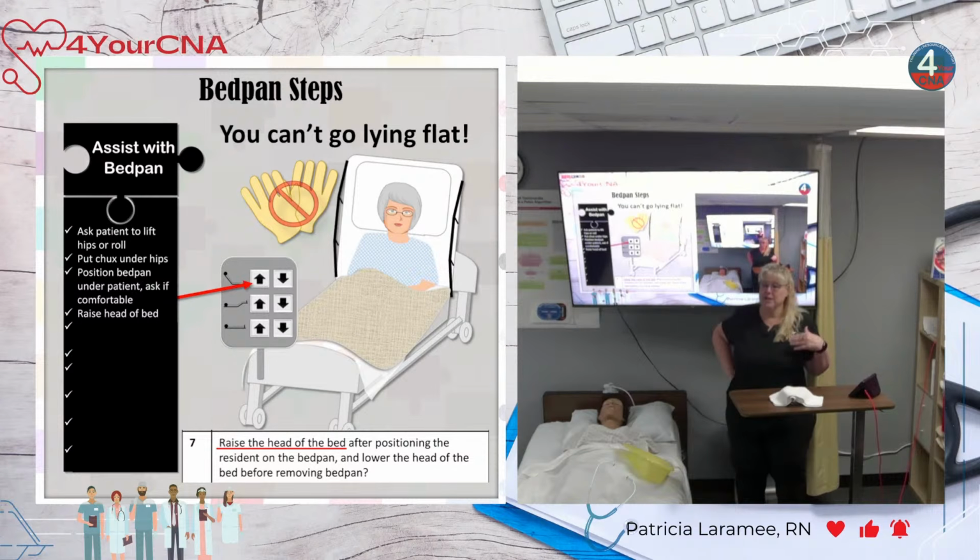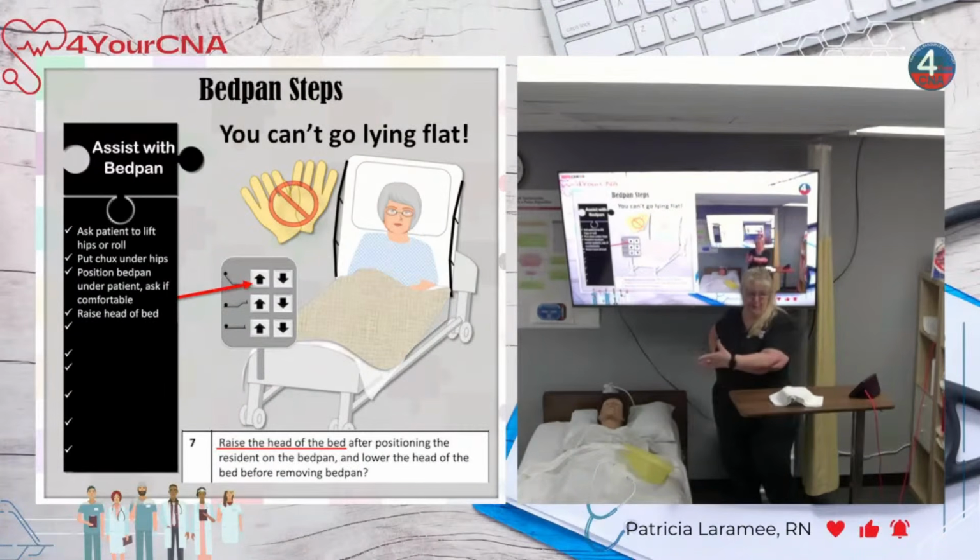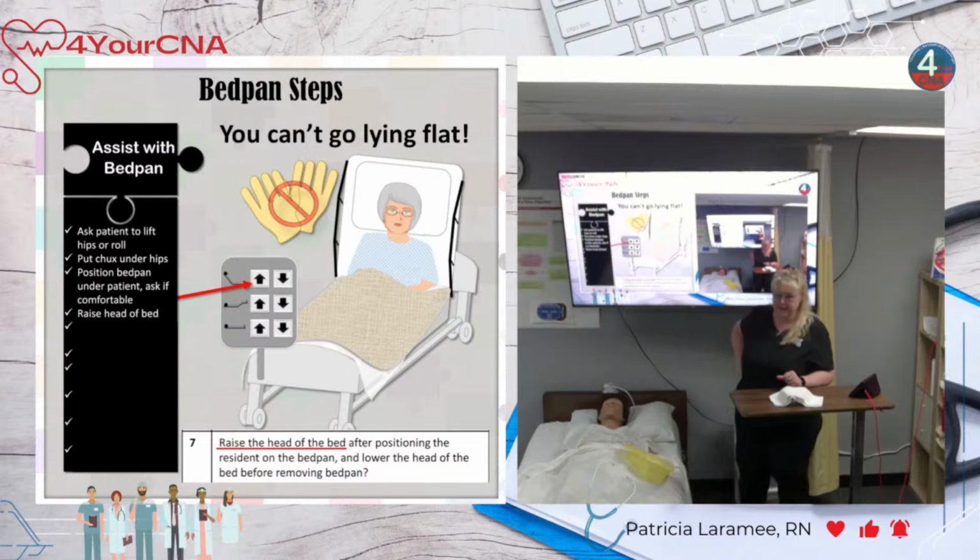Once the patient says, I'm done, and remember, they're not really using the bedpan, right? We just put it under them. They're fully clothed, not really using it. After about 3 seconds, they're going to say, I'm done. And you're going to come back around the curtain and we're going to finish up the skill. Got it? Simulation skill. Well, your patient didn't really pee in the bedpan, so there's nothing in the bedpan, but we're going to pretend there is for this next part.